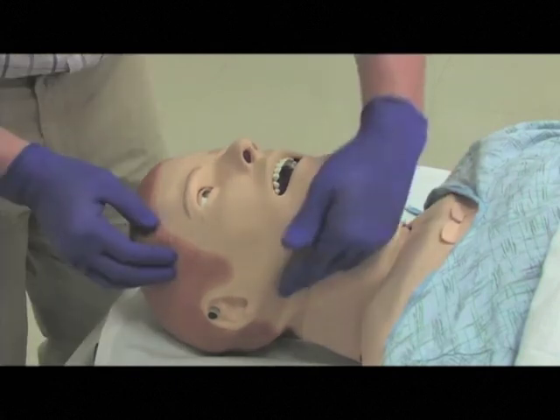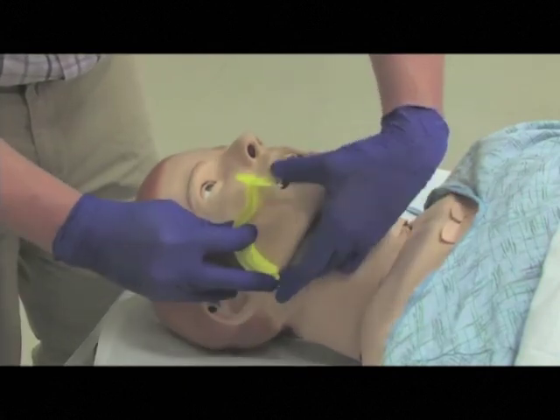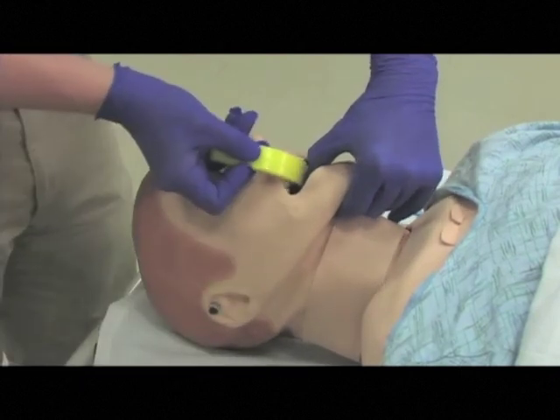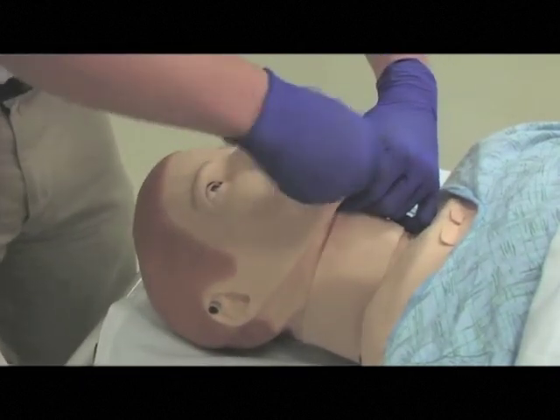With an OPA insertion, I'm measuring from the angle of the mandible to the mouth. I'm going to grab the mouth and take control of the tongue with a little fish hook. Notice how I put the OPA in backwards first and then twisted it 180 degrees to help get over the base of the tongue.